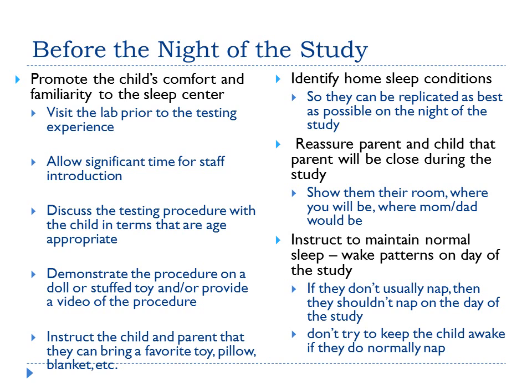You want to instruct the parent and child to maintain a normal sleep-wake pattern on the day of the study. If they don't usually nap, then they shouldn't nap on the day of the study. On the other hand, if they normally take a nap at 2 in the afternoon, then you want to make sure they repeat that on the day of the study. Don't try to keep the child awake if they normally do nap. Try to repeat the exact same procedures that the people do at home on the day of the study as much as possible. Let's go on to our next slide.